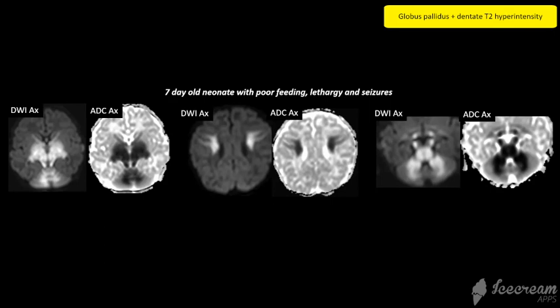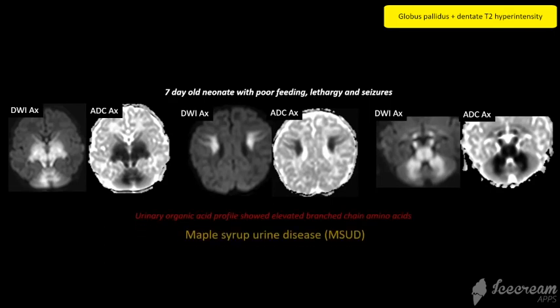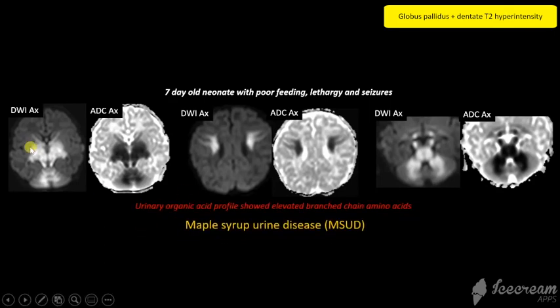This is a classic case of maple syrup urine disease. You can see that in addition to involvement of the myelinated white matter, there is involvement of the globus pallidus and dentate nuclei.